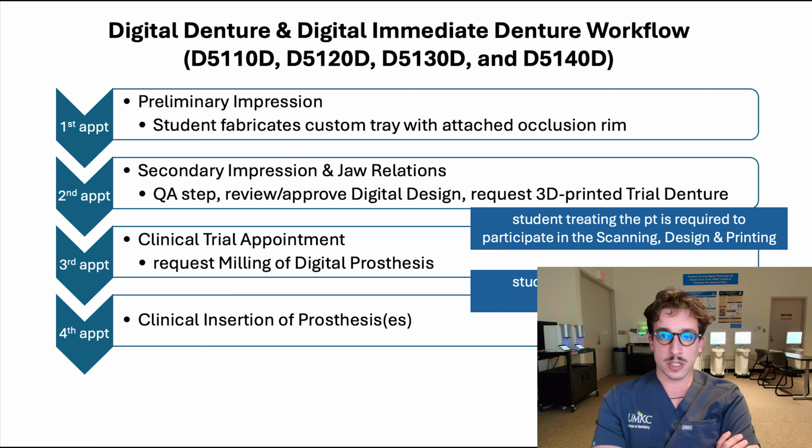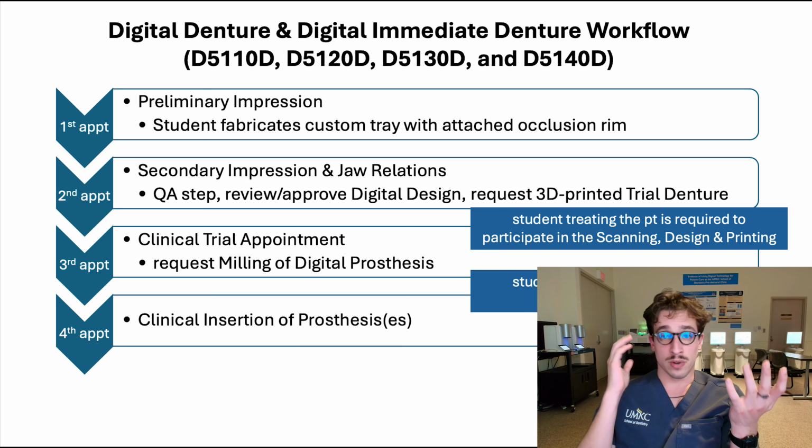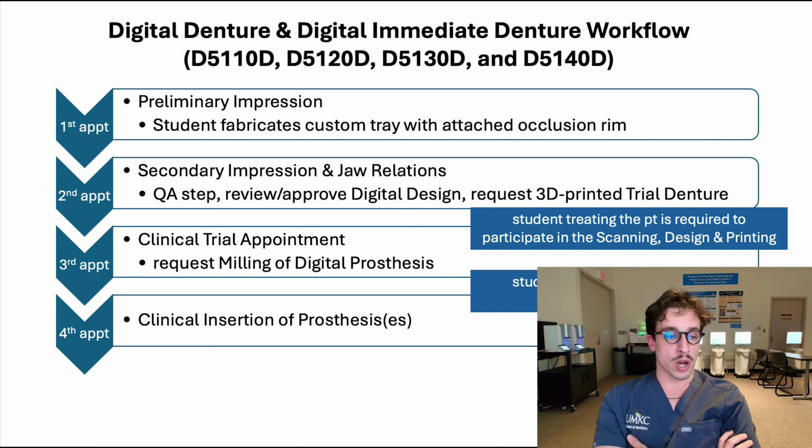But the purpose of this is just to explain the process of a digital denture to you, because realistically, when you get out into private practice, for most of us that are going to be doing dentures, you might not want to do it a traditional way. You might, but you might want to do it in a more digital workflow. And the purpose of this is so that you're going to be familiar with this workflow, so that when you get out into practice, you know what to expect, you know what you're doing, and you also are able to see the two ways to do it. You're going to graduate having done both a conventional denture and a digital denture, and what this will allow you to do is understand what it is that you'd prefer, and you can come to those decisions on your own.